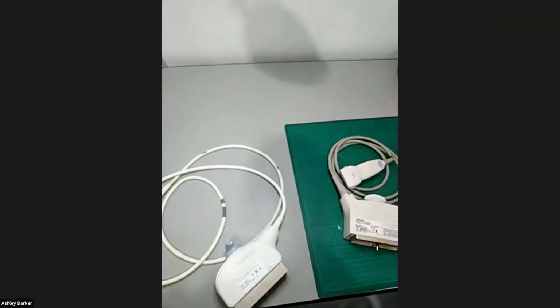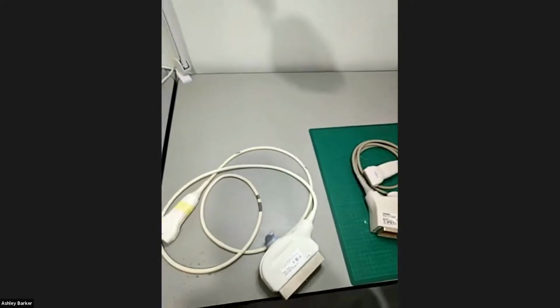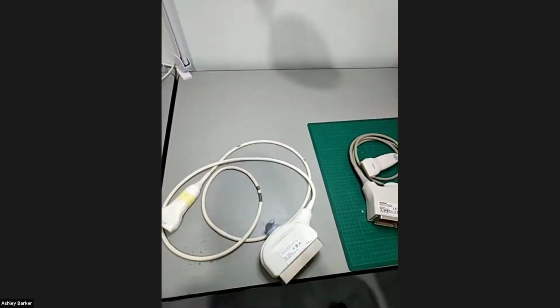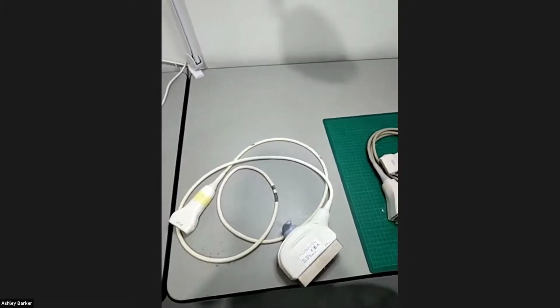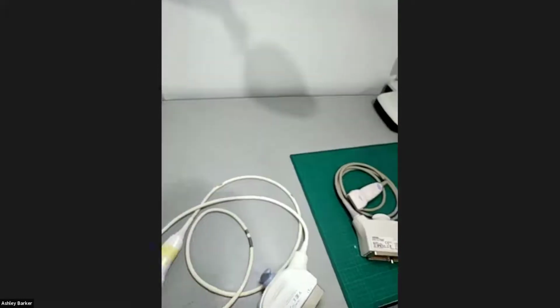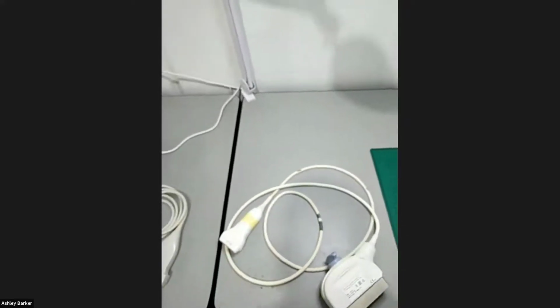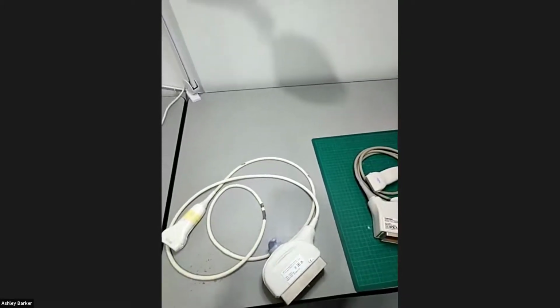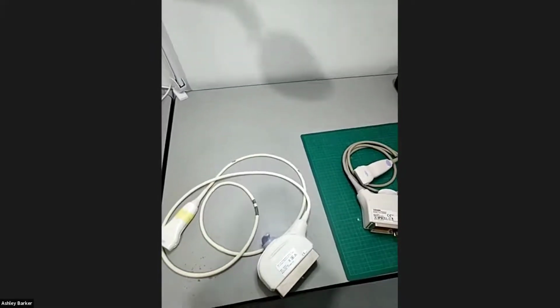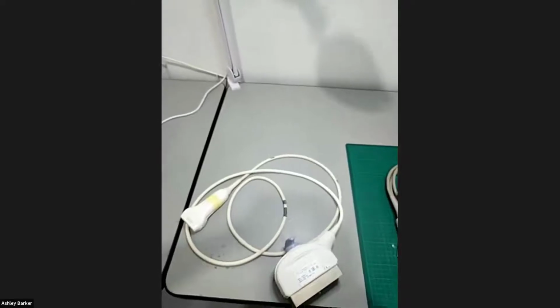Would that make them less susceptible to dropout of your sound waves if they're dropped onto the probe face? I think it's going to be... I don't have enough data on that to make an absolute assessment, but I reckon they're going to be about the same because they're still very fragile, silicon based. I think they make them in a MEMS process, so they're going to be fragile. The issues they've got at the moment: they draw less power, and the frequency range on the crystals is much, much better. What that means is you can have a probe that does full body, basically anywhere you want to put it. You've got great frequency ranges, so you can do whatever you want with it.